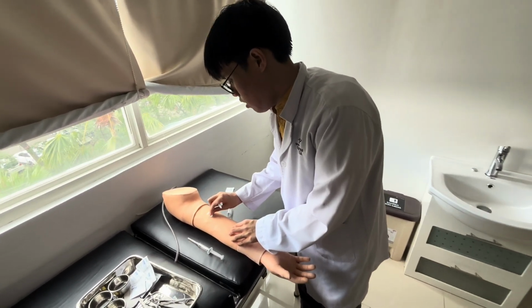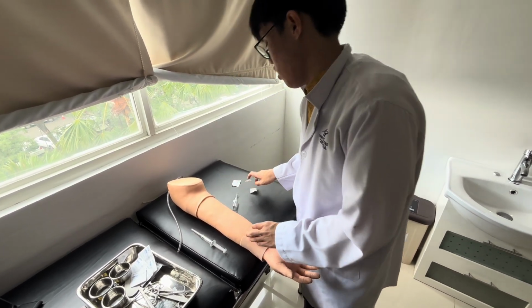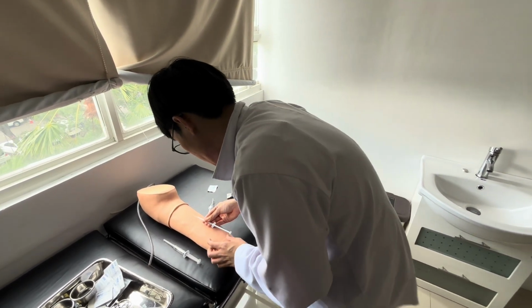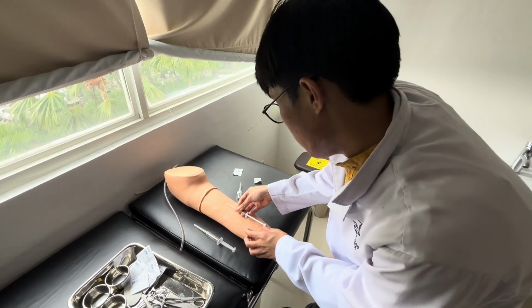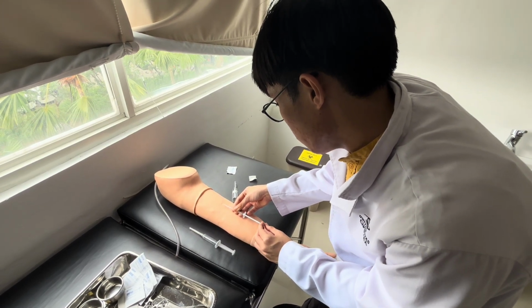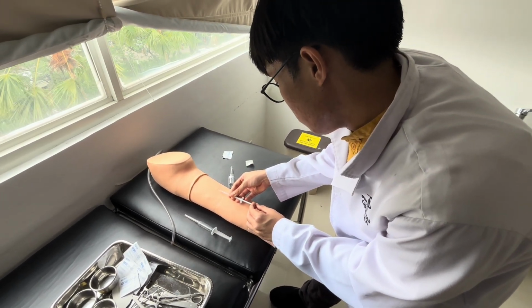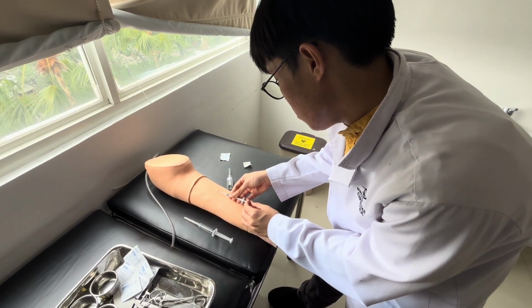So do it from the inside to outside in a circular motion, and after that you will want to inject the needle. Make sure the hole is facing upwards. You want to inject the needle at around 10 to 15 degrees, so around that much. And do aspiration, make sure you don't hit a blood vessel. And then you inject the medicine into the patient as you slowly release the syringe.